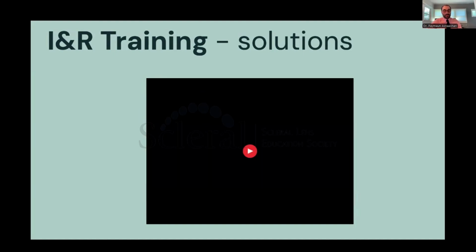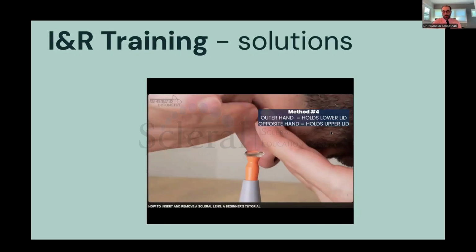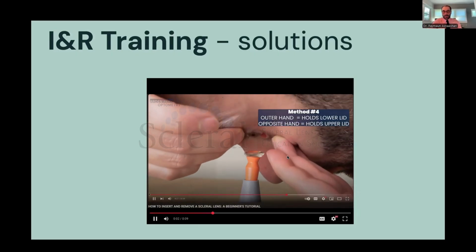So it makes it really easy. You now don't have to hold the lens and it stands up in the air a little bit. You don't have to move so close down to the desk. But again, it's a simple way to use. There are also now lots of other stands out there, and I'll show you some of them. So let's go to the next slide.